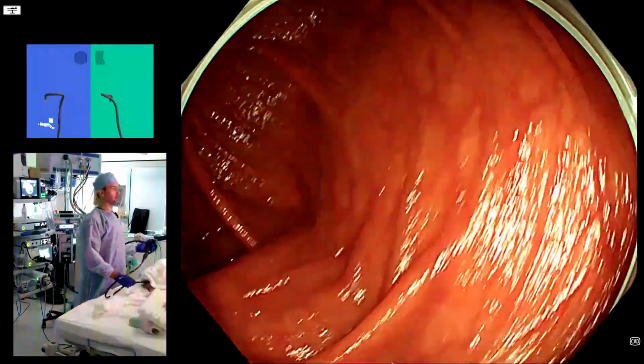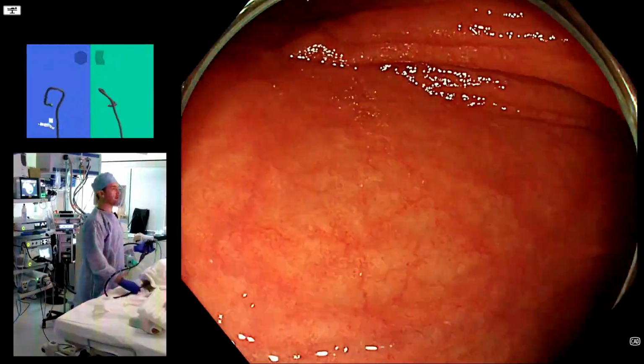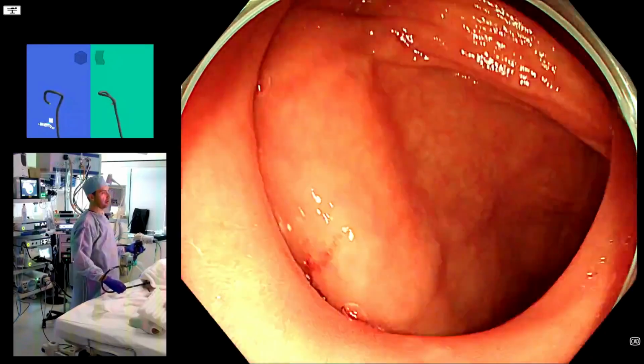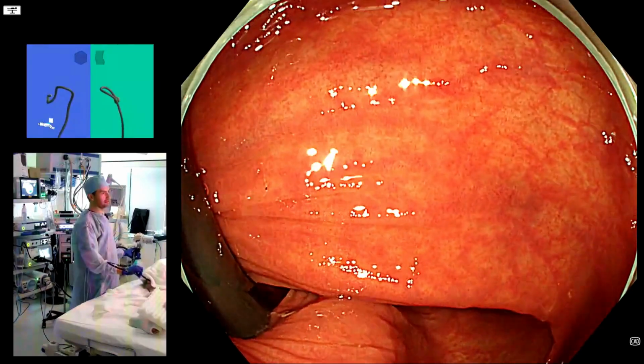What about retroflexion in the right colon? So this is something also proven to increase the rate of adenoma detection, and if you don't do it, the AI is never going to see that area. So to retroflex, we pick our space, we full tip up, we maximize a small wheel, and we just rotate a bit. Oh, how good is that?